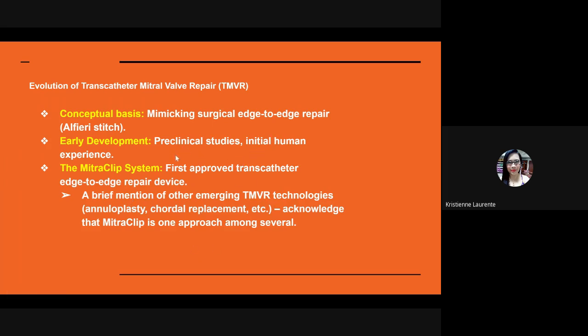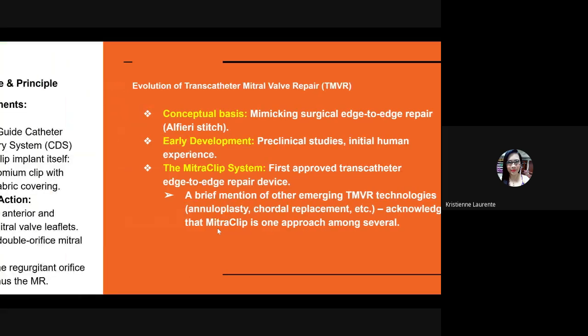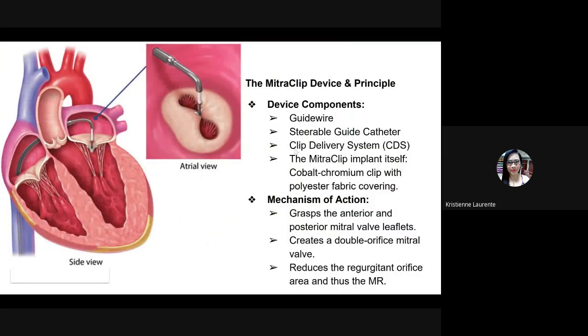The MitraClip system is the first approved transcatheter edge-to-edge repair device. A brief mention of others, like annuloplasty and chordal replacement, acknowledges that MitraClip is one approach among several others.